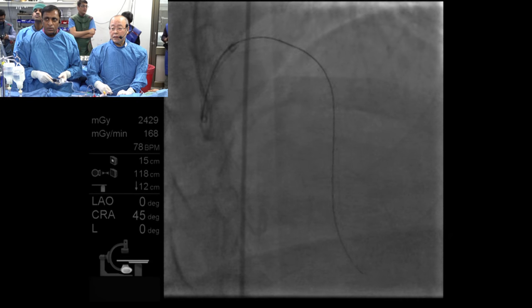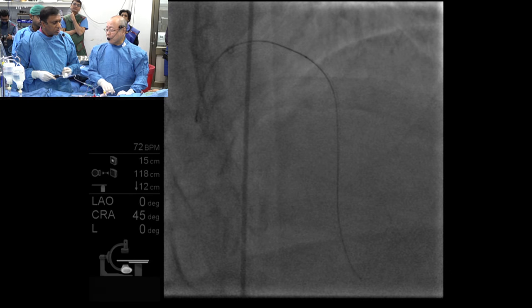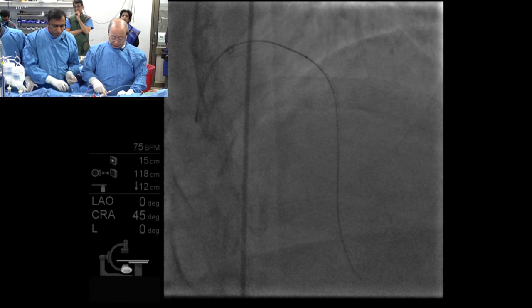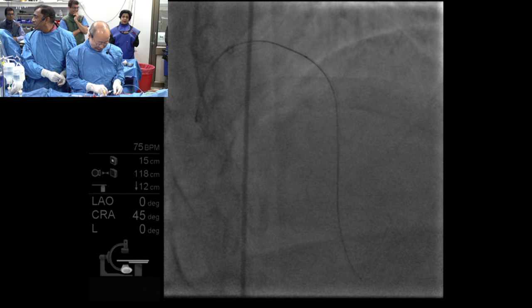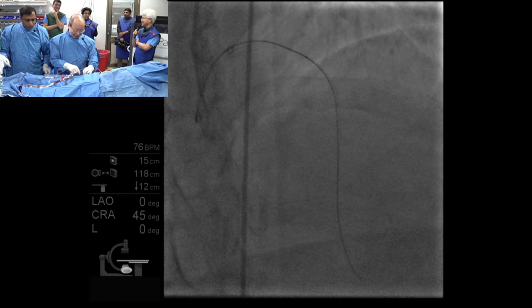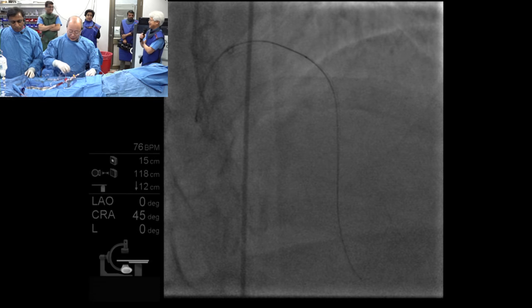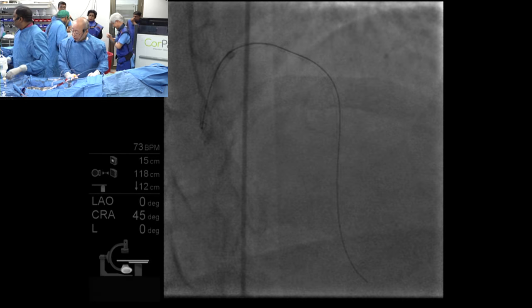It's quite easy now. So, a 2 millimeter balloon to take OCT. 2.15. Good OCT image. Saito sensei tried to use OCT. OCT ready. I'm wondering if the 1.0 millimeter balloon was a little bit small. So I'm taking a 2 millimeter balloon before the OCT. Great.